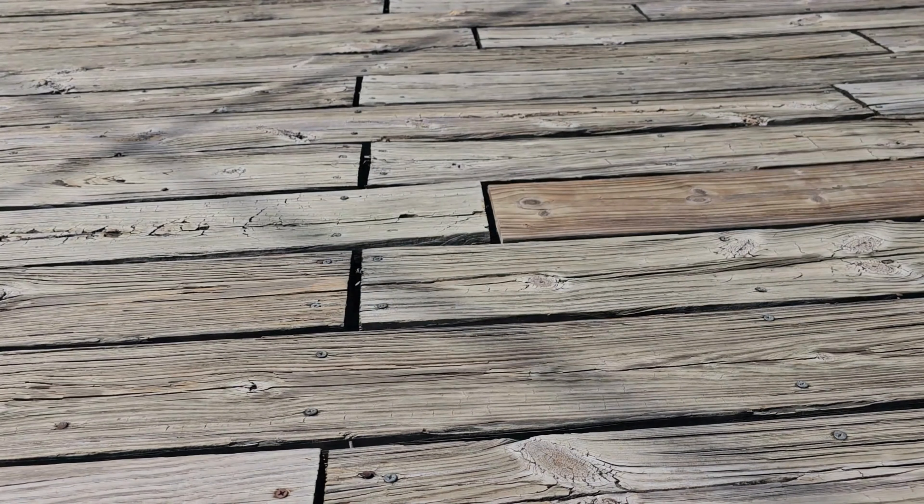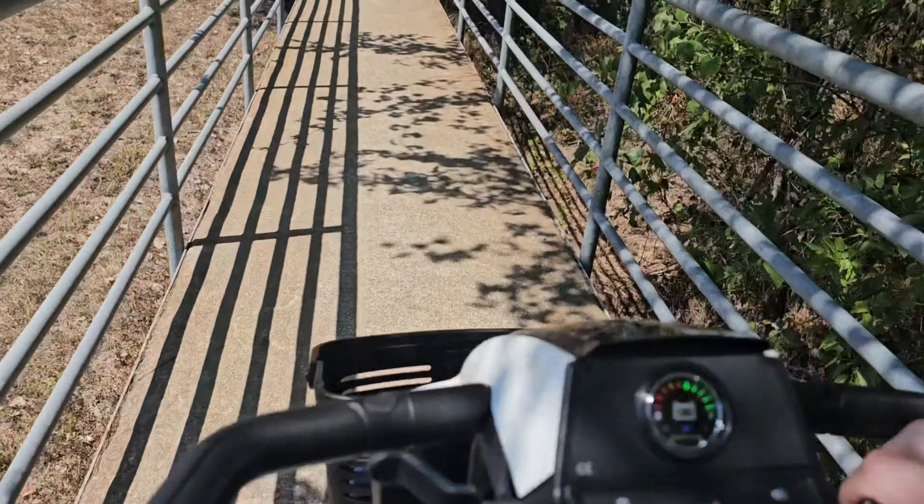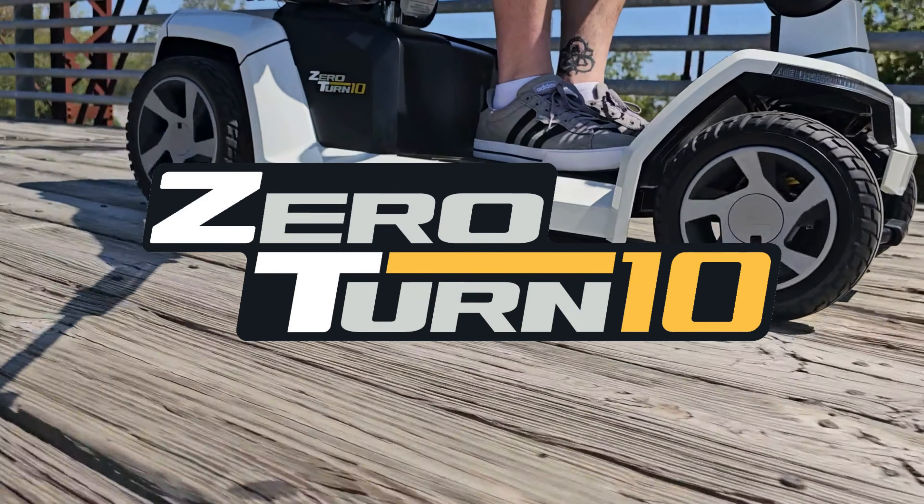Regain your mobility, independence, and freedom with the Zero Turn 10 mobility scooter by Pride Mobility. Order today with Auto Mobility Store and receive a free accessory package.